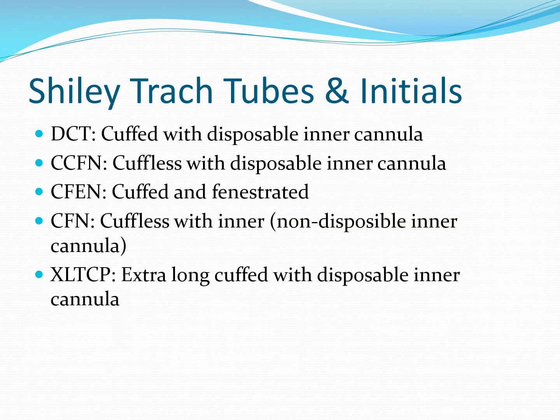So many clinicians who are relatively new to trach tubes, in particular respiratory therapists and nurses, learn the initials. For Shiley, they account for probably about 80% of the trach tubes that are sold out there. There are many more initials than what I've depicted here, but these are the most common ones, okay? Particularly near the top, the DCT stands for cuffed with disposable inner cannula.